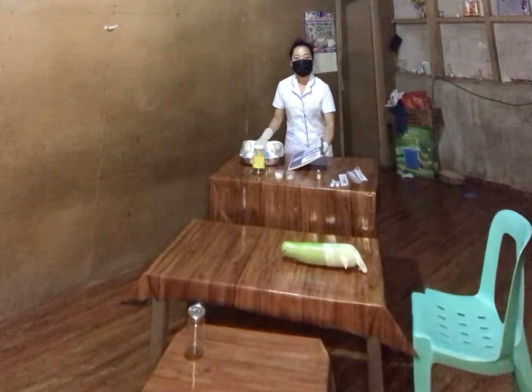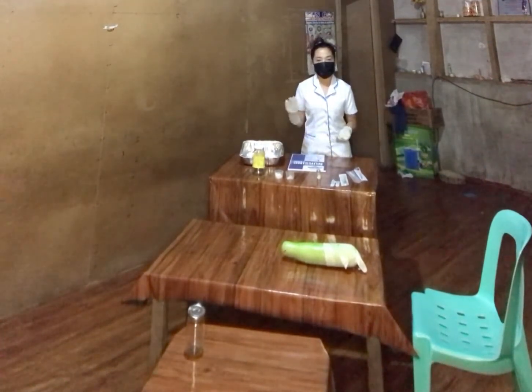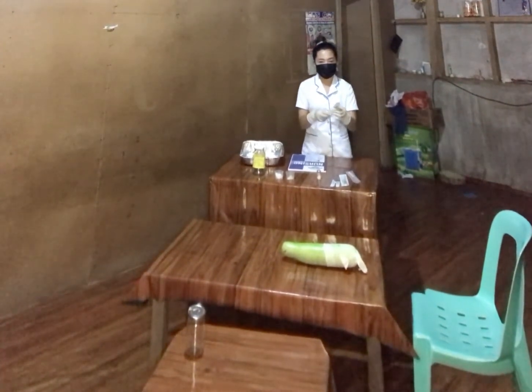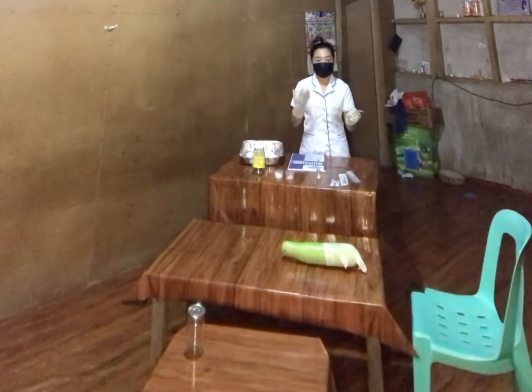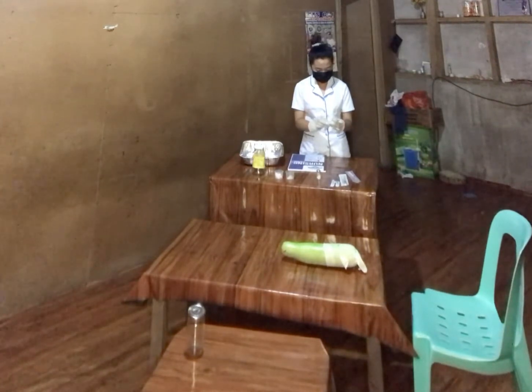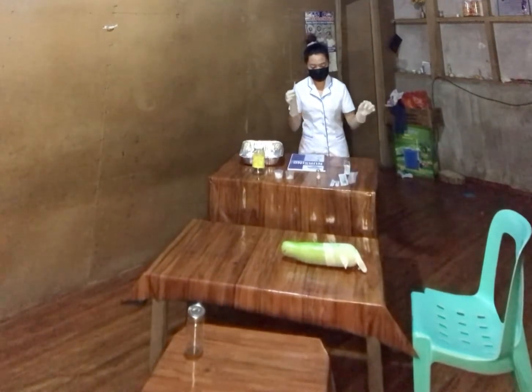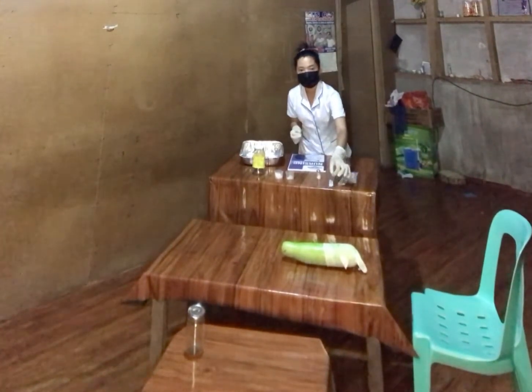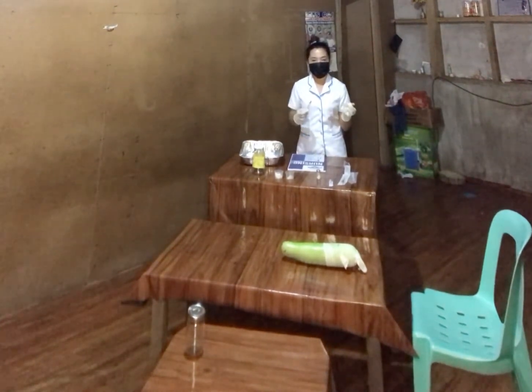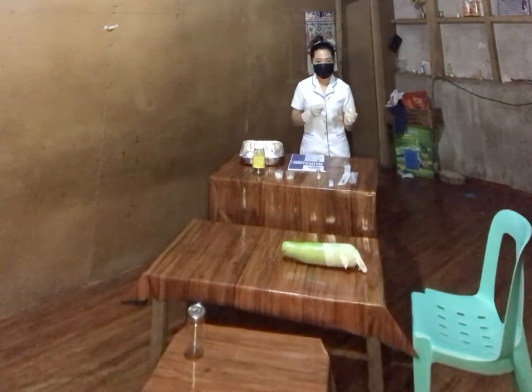So to prepare the medication for an intradermal injection, first we need to get the tuberculin syringe and open the sterile package. So I am going to open this. And the aspirating needle, so this. And connect the tuberculin syringe to the aspirating needle, securing the connection of the needle.